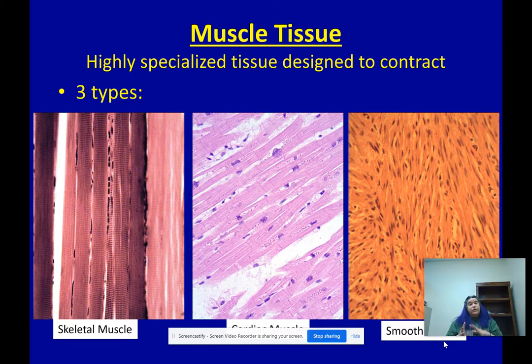Okay, so you've got skeletal muscle and cardiac muscle that look very, very similar. They look almost exactly alike when you look at them, so you need to look for landmarks. One of the things with skeletal muscle that you have to remember is it's attached to your skeleton for a reason. Let's say your bicep. It has to go across a joint in order to actually pull and make this bend. That means that those cells have to be extremely long, especially for something that is microscopic in structure.